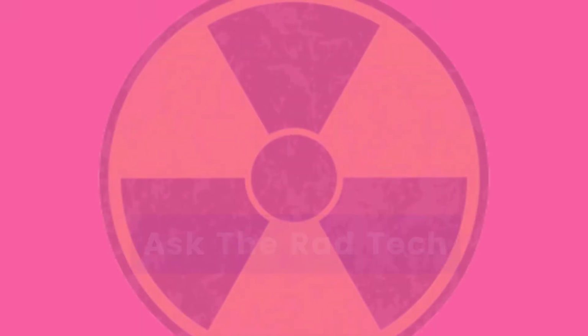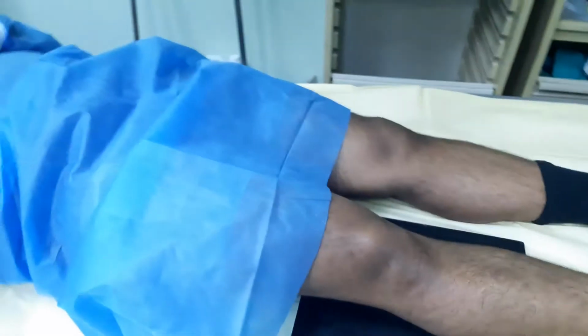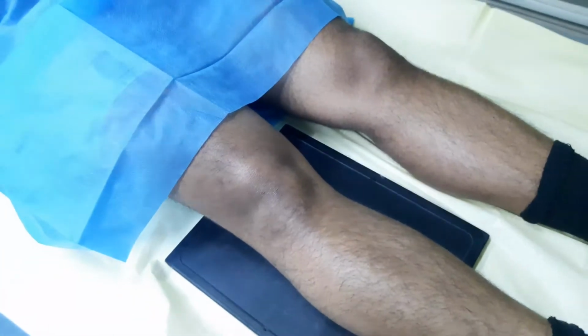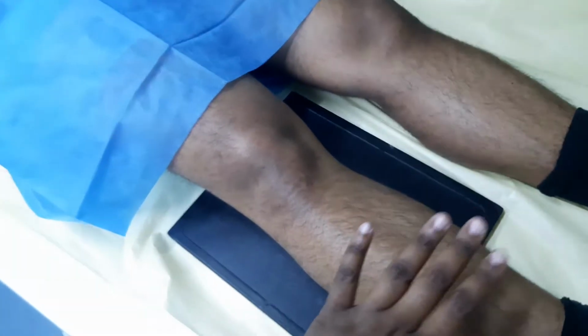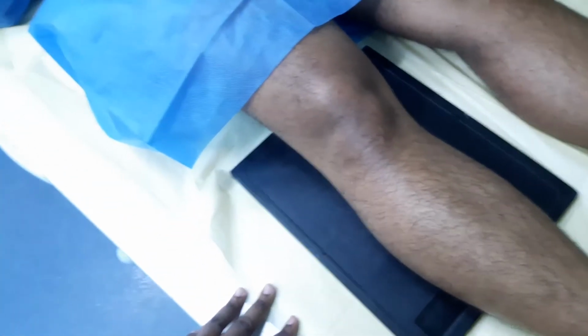I'm in need of an x-ray. Okay, so I'm just raising the table. My patient doesn't want to be in the video, he said. So we're going to be looking at the AP and then the lateral knee. We're looking at his right knee in this case. Of course, after your position, you put your markers and all of that, but we're not focusing too much on things like marker placement right now. We're just looking at the positioning for the AP and the lateral knee.